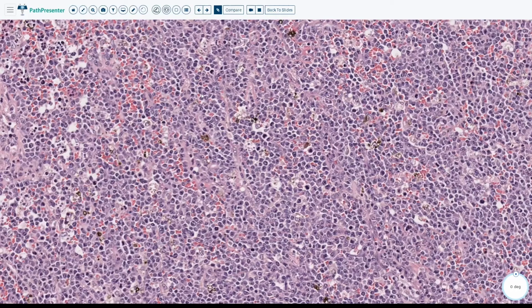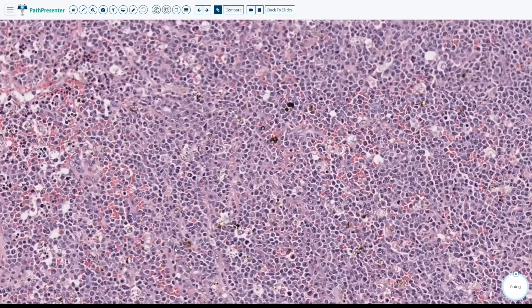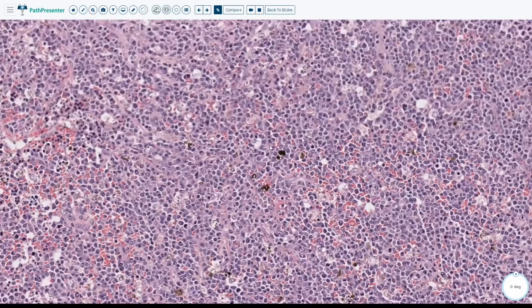And you can also have multilobated cells as well. But the idea being that these cells, even though they're relatively large and atypical for lymphocytes, they're still relatively small and discohesive. So we're not thinking about things like carcinomas and whatnot.